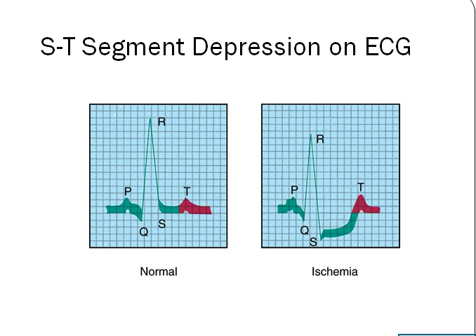As the person who's doing the exercise test, it's really not your job to say. But if you see something like that, again, the cardiologist is often in the room or possibly close by if they're doing any testing. So oftentimes the technician can't say anything, but that would be something that would be looked for during exercise.